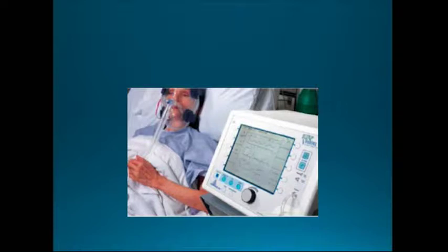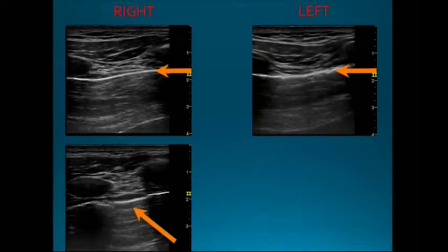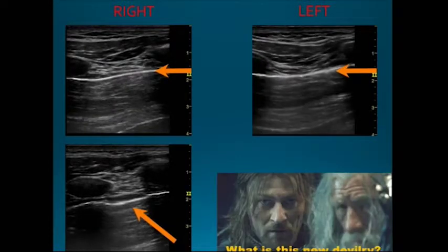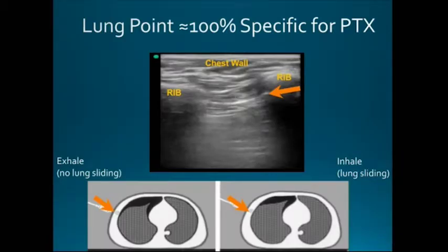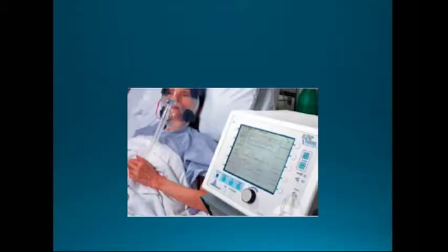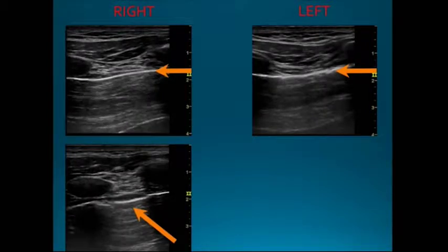And you call for help, and the emergency room physician comes in and grabs an ultrasound probe as they're coming in, and they apply the ultrasound probe to her chest. And so they just pop the ultrasound probe on the chest here, and on the right-hand side they see an image that looks like this, okay?